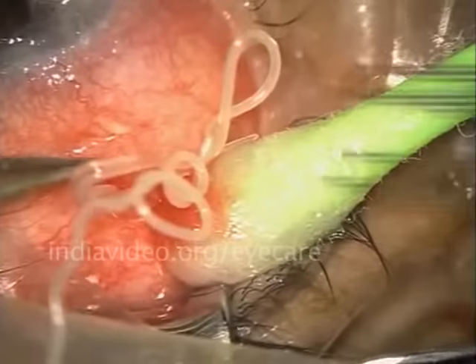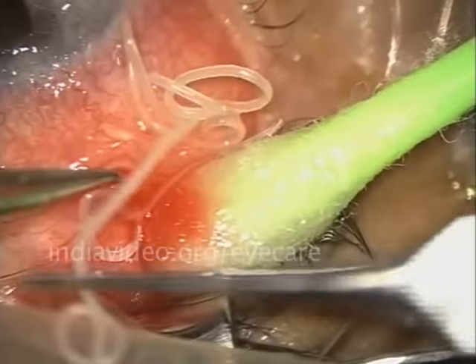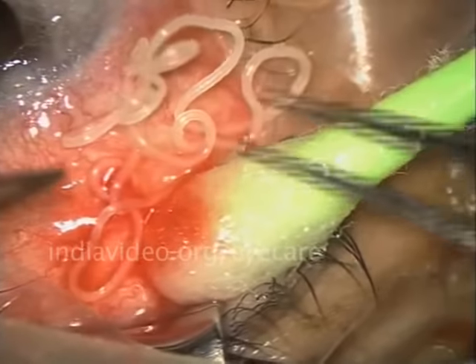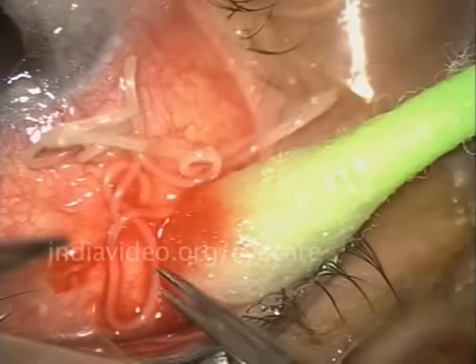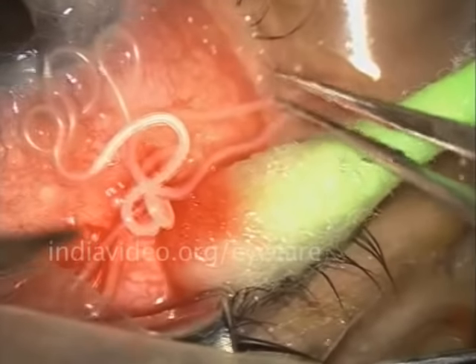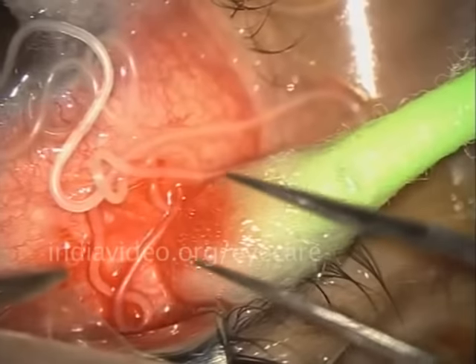Trying to untangle it and pull it out. I feel that the distal part — that means the end part of it — has got caught somewhere in the eye. I will be putting the rest of the worm back onto the eye in the hope that it will relieve itself from the eye. Watch carefully as the worm starts wriggling out of the eye.